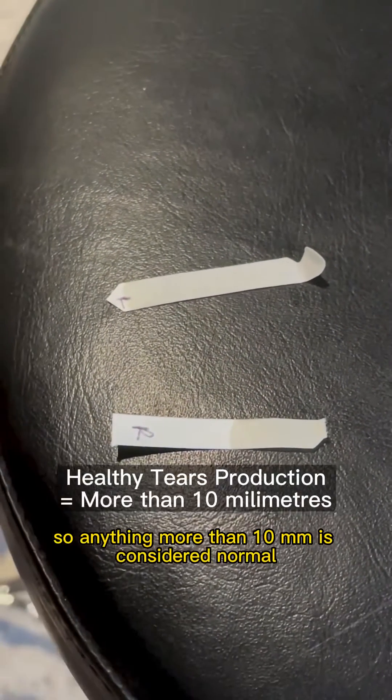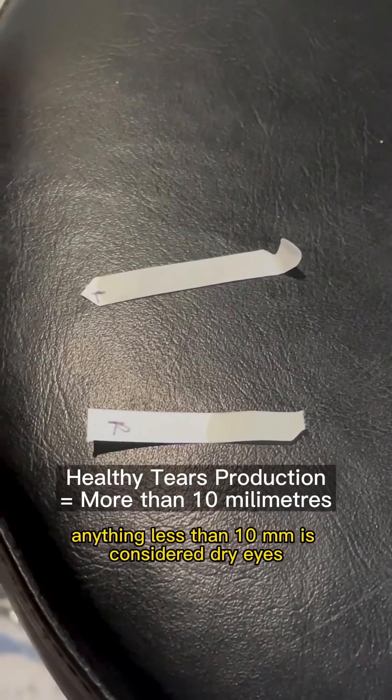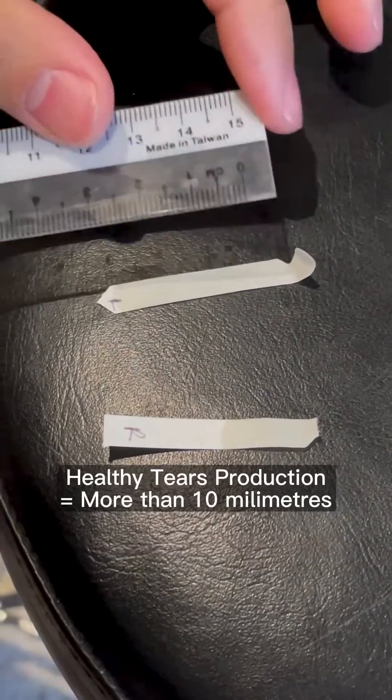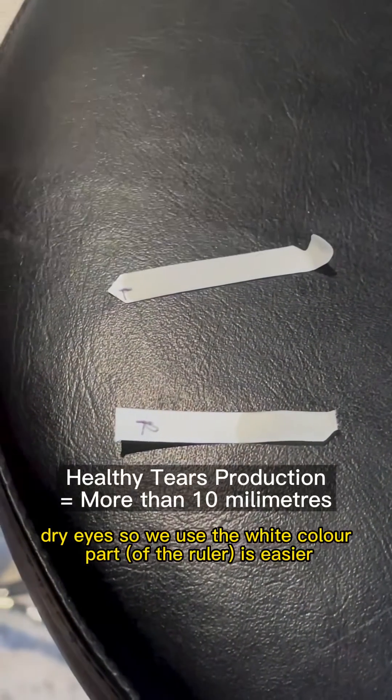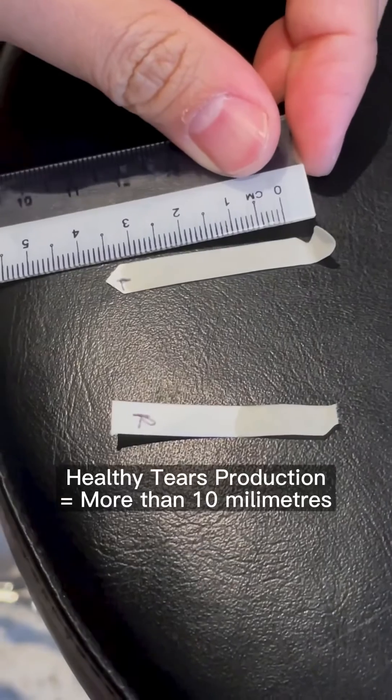Let's measure. So anything more than 10 is considered normal, more than 15 is even better. Anything less than 10 is considered dry eyes, and lesser than 5 is very very dry eyes. So we use the white colour part — it's easier so everyone can see. Let's start the measuring here.